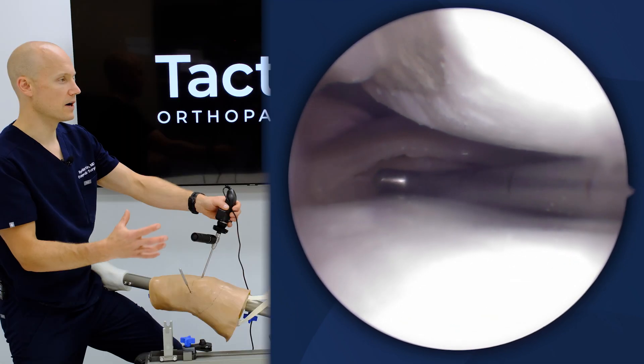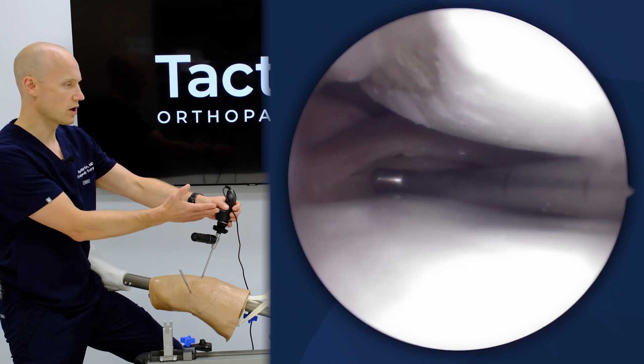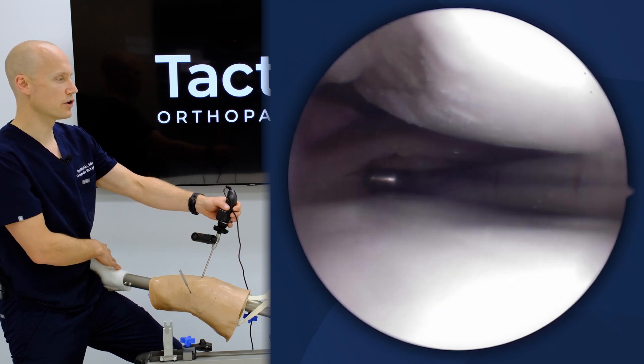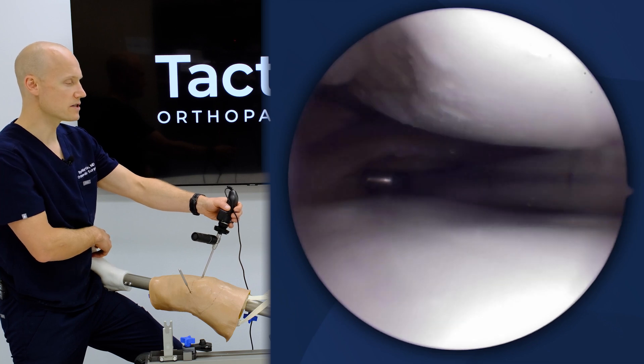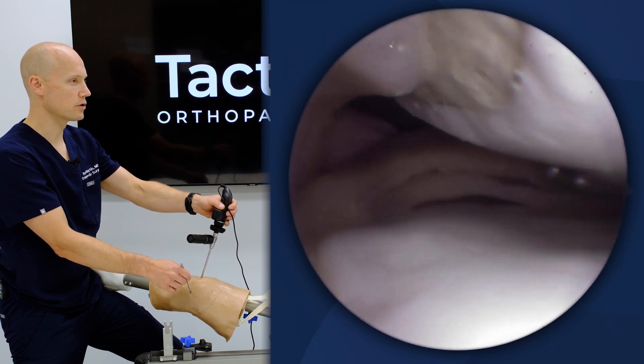Whereas the whole mechanics of the technique — where I position the scope, what angle my view is, what position my hip is at, where my foot is, where my leg is holding the patient's leg — this all replicates the exact same environment that I would encounter in the operating room.